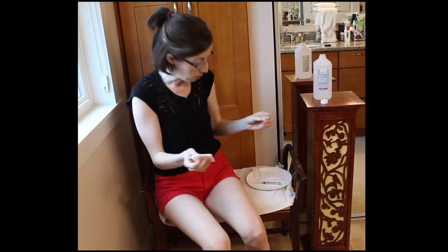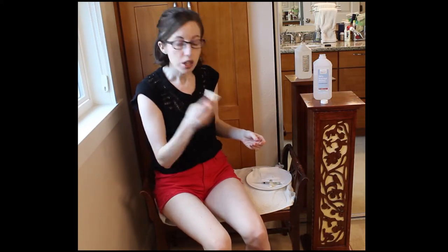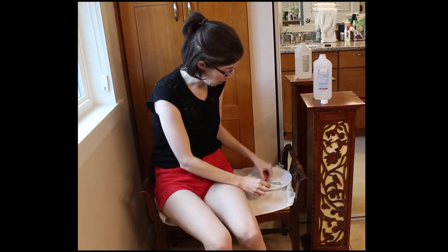I think as a patient, especially when you're trying something new, you're kind of like, what is it actually like? So you have to clean the top of the actual medication, which I just did with the alcohol swab.